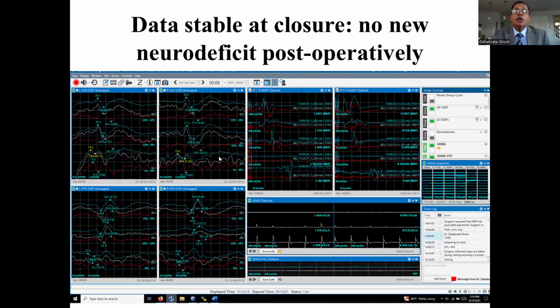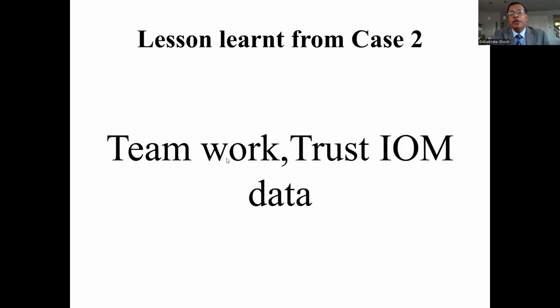And at the end, at closure, MEP remained stable, as also the SSEP. The EMG was quiet. Again, this case teaches us that teamwork is very important in IOM, and if the surgeon follows the proper alerts given by the IOM team, the prognosis is good. The patient did not have any weakness or any neurodeficit in follow-up.